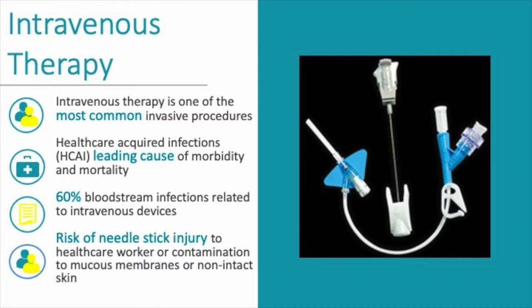So making sure that if I was to do an IV right here, right now, and another colleague from this trust were to do an IV there, then we would be doing it exactly the same way, by the book, each and every single time. It makes it safe, it's efficient, and it reduces patients' harm. We also have the risk of needle stick injury to you guys, so we want to make sure that we are reducing that risk as much as possible as well.